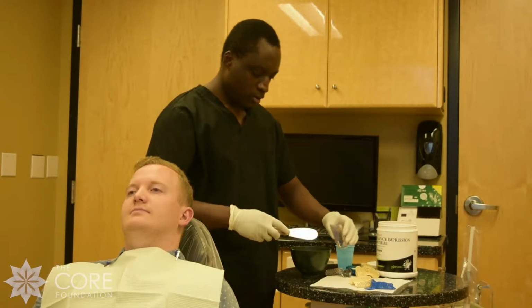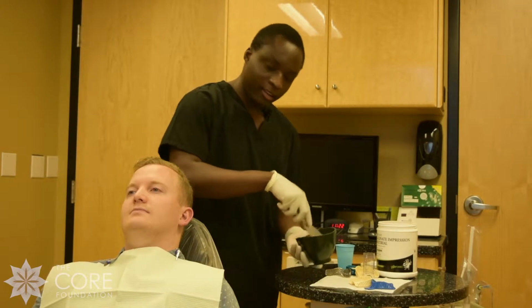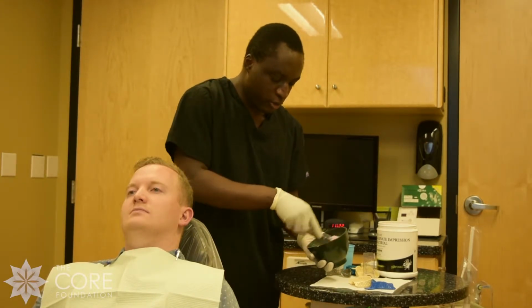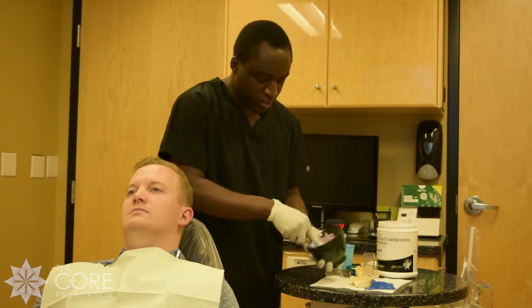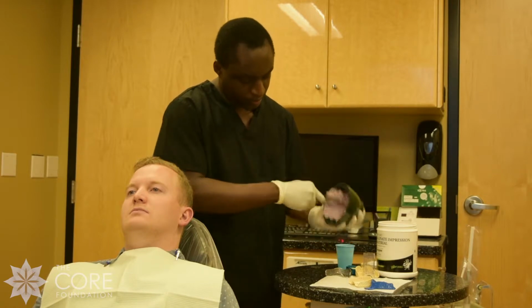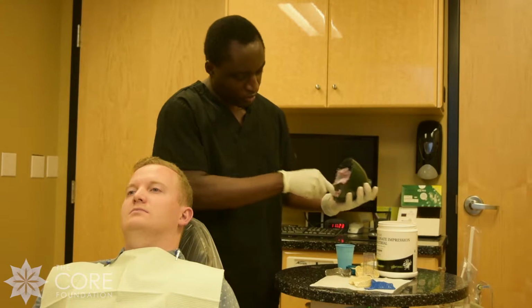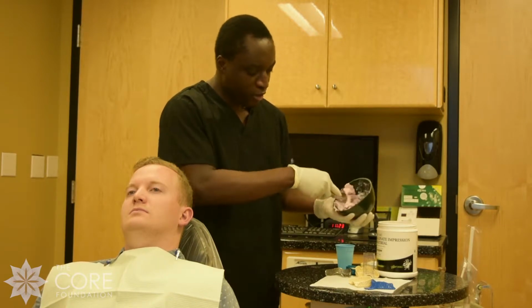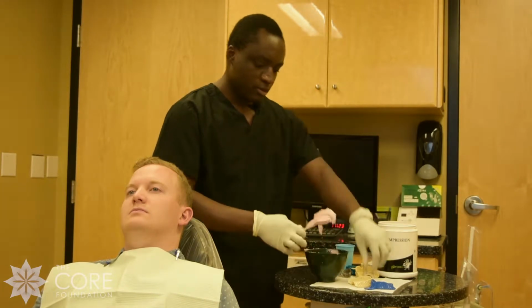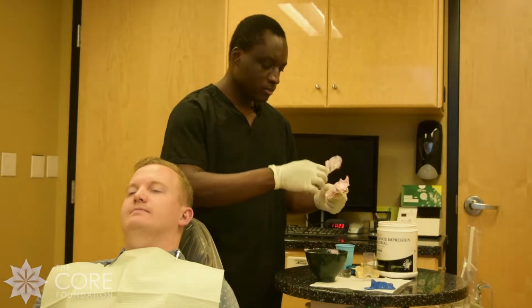Okay, you go ahead and pour it in there. And at this point, you have about 25 seconds before your impression starts setting. So you want to make sure you mix it really well and really fast. If any of you have cooked before or made a cake, it's just like mixing your batter. So once we have it at a consistent pace, we'll go ahead and fill it in.